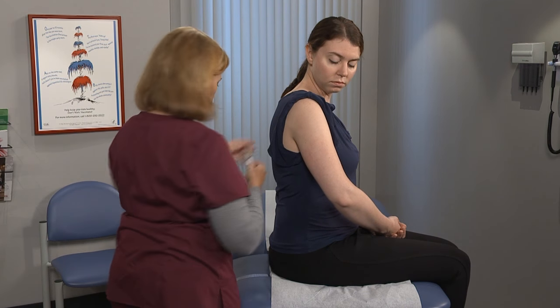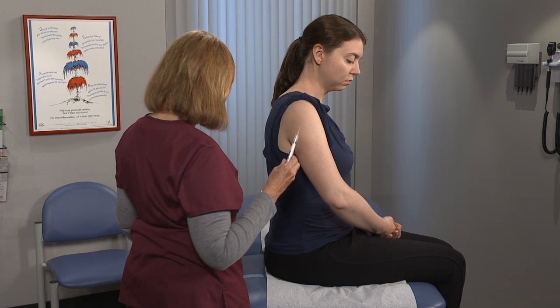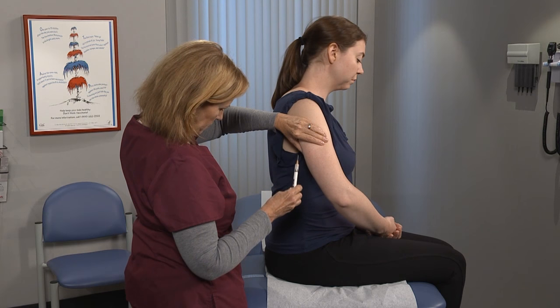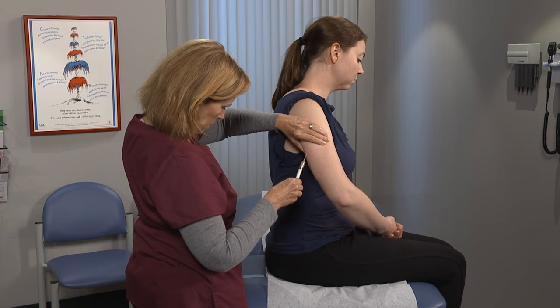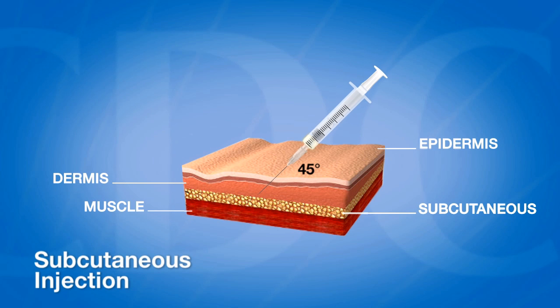Hold the syringe in your dominant hand and remove the protective cover from the needle with your other hand. With your non-dominant hand, pinch up some fatty tissue. With your dominant hand, hold the syringe and insert the needle into the fatty tissue at a 45 degree angle.